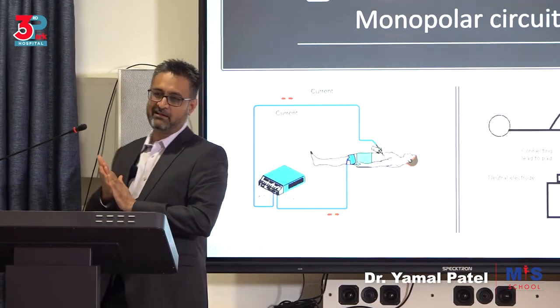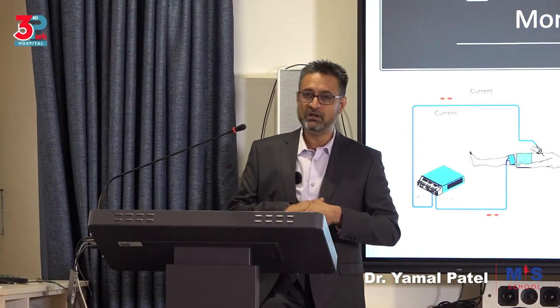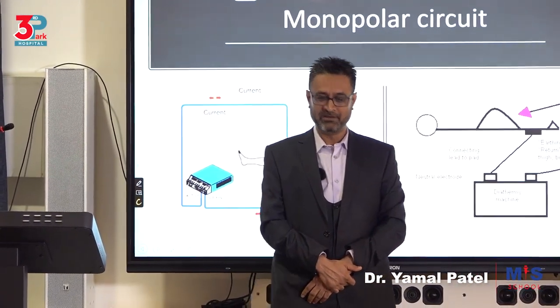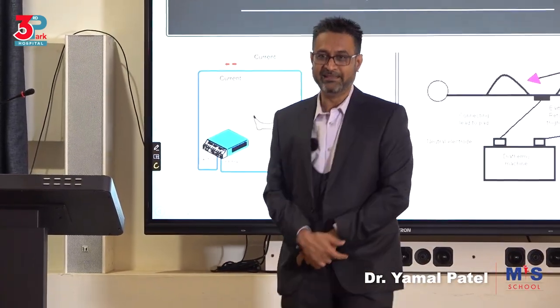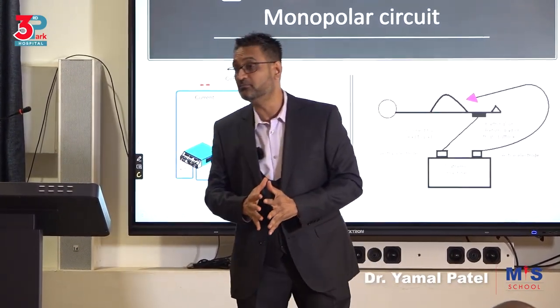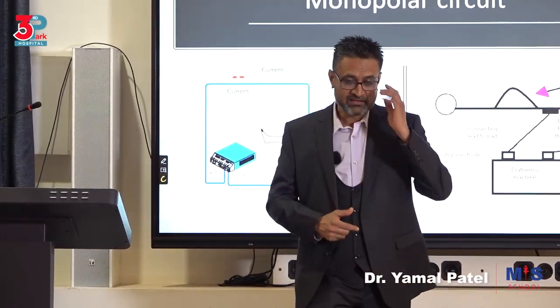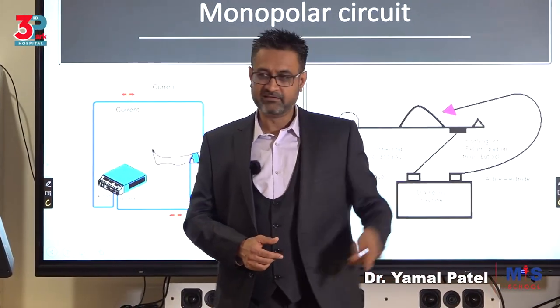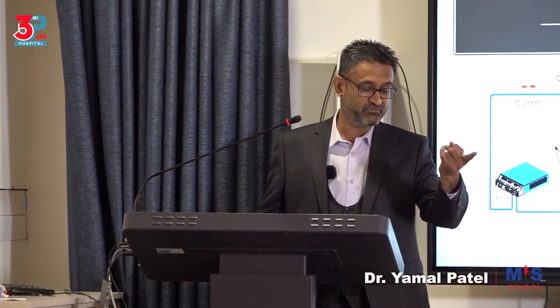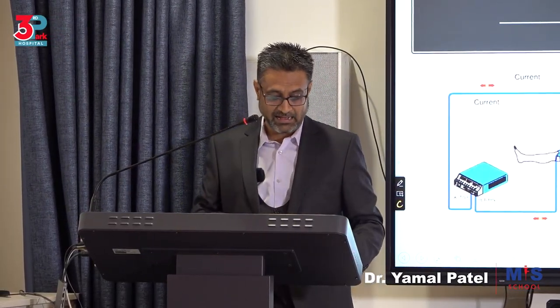I take lots of classes on energy because this is very poorly understood and not covered in classes when we are doing post-graduation. And then the day you're out there, you're expected to start using it. So all people know is, yes, blue and yellow, blue and yellow. Blue to coag, yellow to cut. I tell them no, that's absolute nonsense. That is not how it's supposed to be worked with. And when something doesn't work, you'll see the surgeon just say, increase it, increase it. I mean, my friend, that is dangerous work you're doing. So please, that's not how energy is to be used. We may have some time, we'll do some energy demo as well. I'll show you exactly what needs to be done and how.